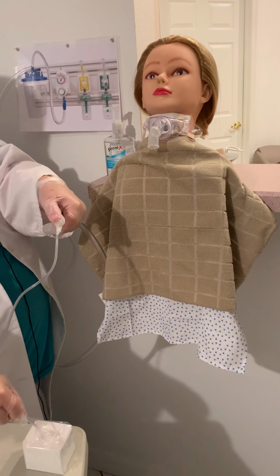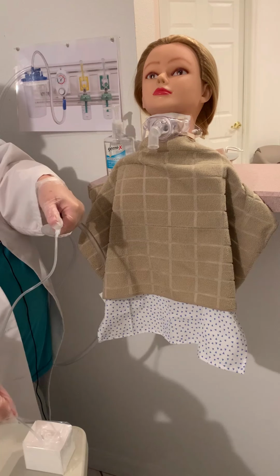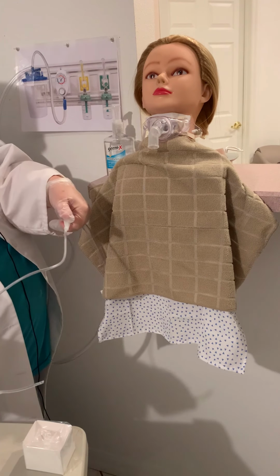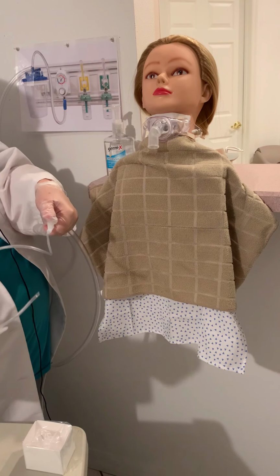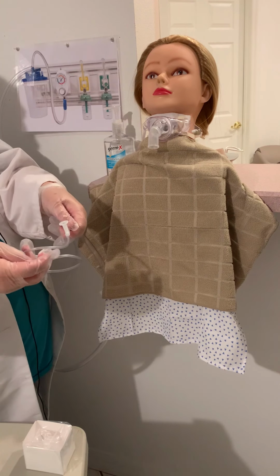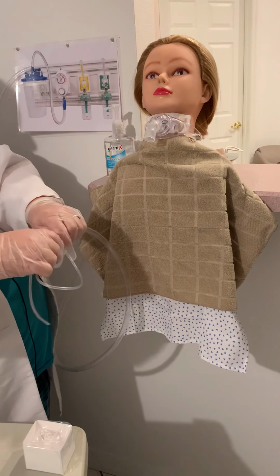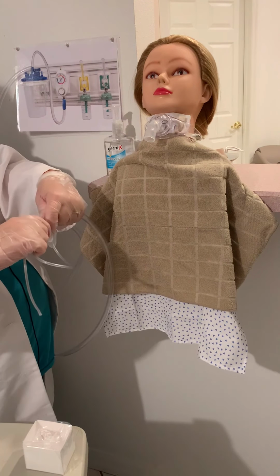All right, Mrs. Harper, are you feeling any better? You're sounding better, you're looking better. So you're always going to reassess while you're waiting that 1 minute in between. And she looks like she's doing a lot better. So we're going to go ahead and call it good for the suctioning. So we're going to go ahead and disconnect our tubing.